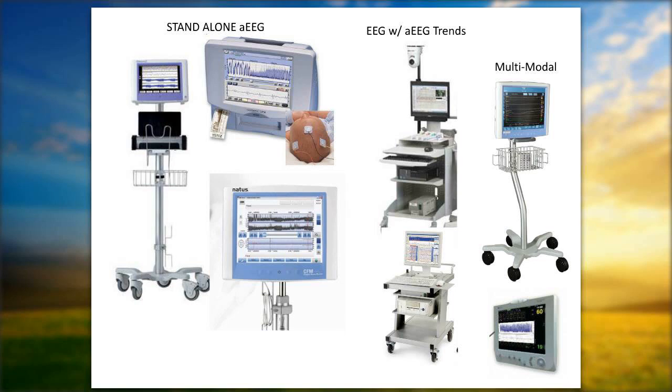The third category is one that I'm starting to see more and more, and this is what's called the multimodal. There are a couple devices out on the market that are now available, and what is really nice about them is that they display on one screen various information from various monitors. So for example, you might have it connected to your Blanketrol device while a baby's being cooled.